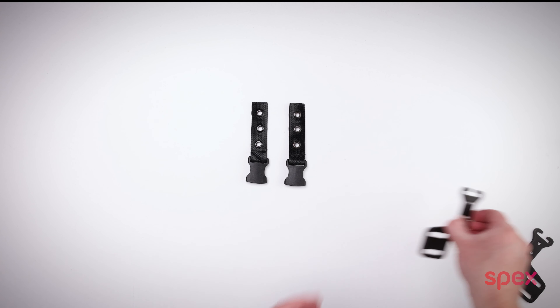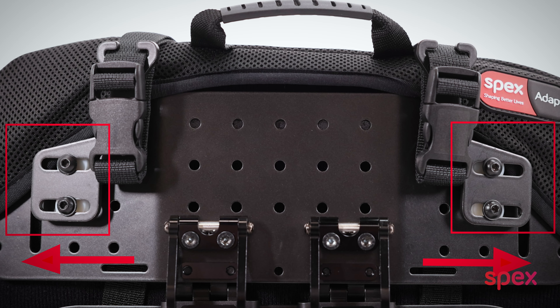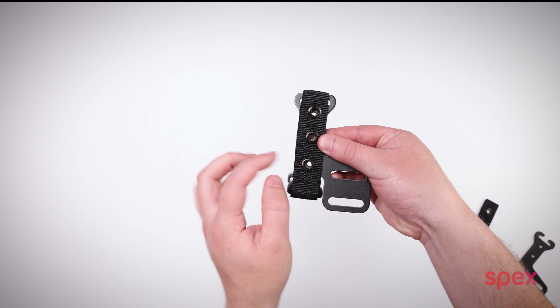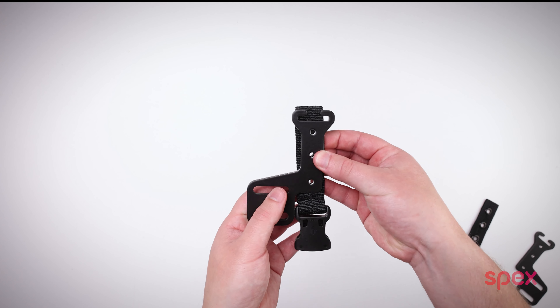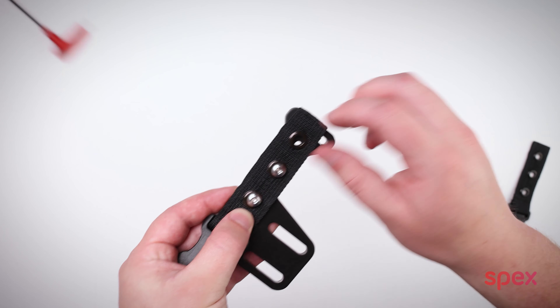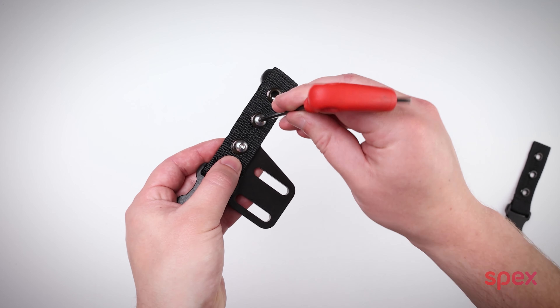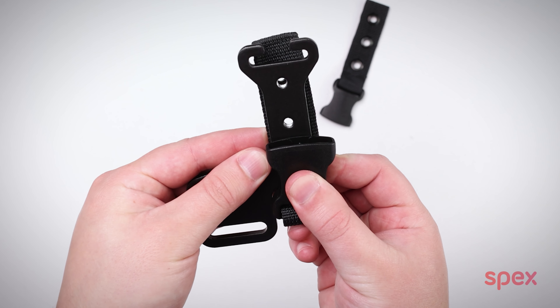Take the harness guides and make sure you have them around the right way — these slots will be facing out. Now line up the attachment strap so the holes in the guides line up with the eyelets on the harness like so. Take the two three millimeter allen head screws and tighten them into the threaded harness guides from the back side.